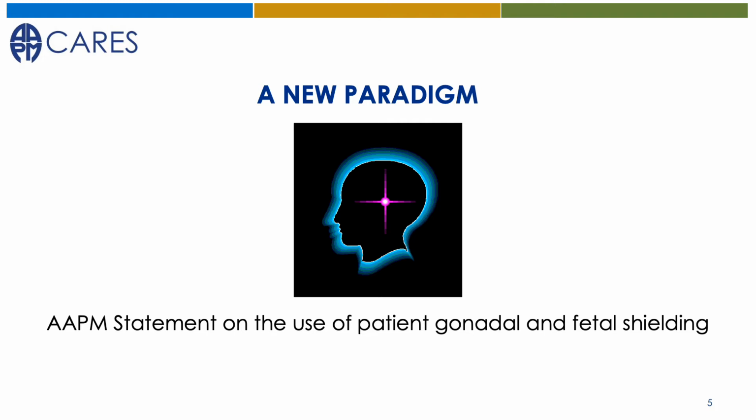Since April of 2019, there has been considerable discussion about the use of patient gonadal and fetal shielding in diagnostic X-ray imaging, prompted primarily by the publication of a position statement on this topic by the American Association of Physicists in Medicine, otherwise known as AAPM. This statement is based on a consensus among medical physicists that the routine use of patient gonadal and fetal shielding, once a mainstay of patient radiation protection, may no longer be best practice for protecting our patients.